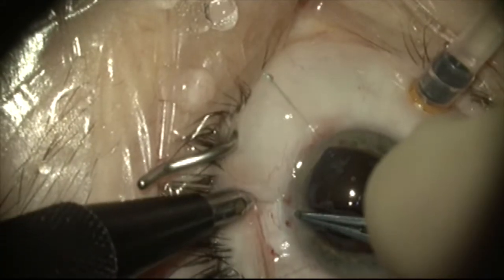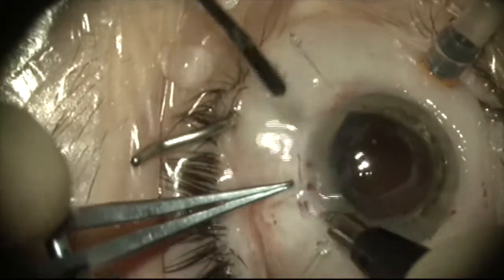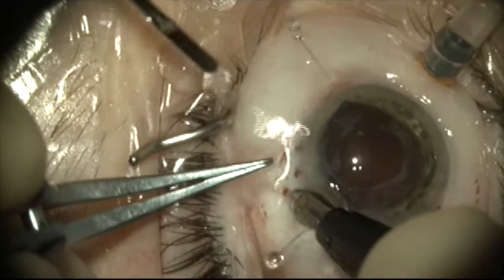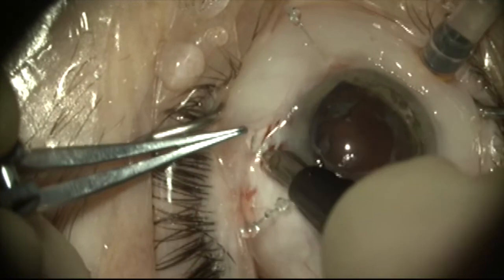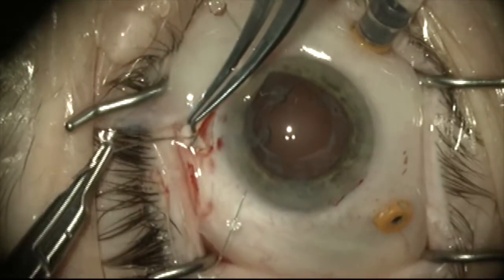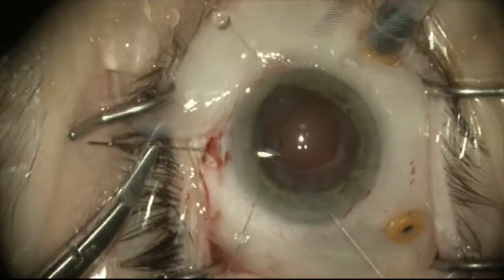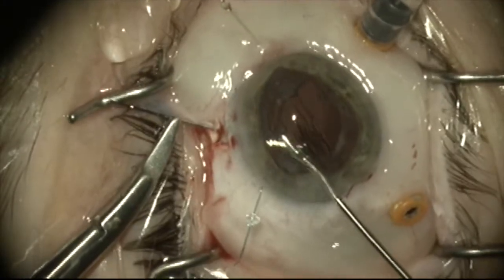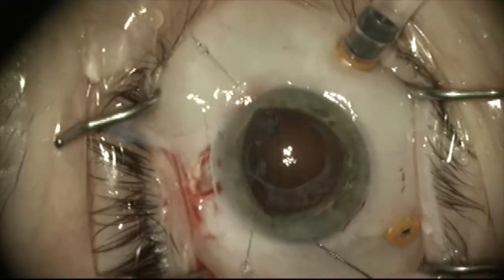I've made a decision that I'm going to place a lens in the sulcus and suture one haptic to sclera so I don't have to worry about it rotating and developing a sunset syndrome, as the zonules in this case were weak at 6 o'clock. So here I'm going to place a 9-0 prolene suture through a scleral flap under the iris out through the clear cornea incision.